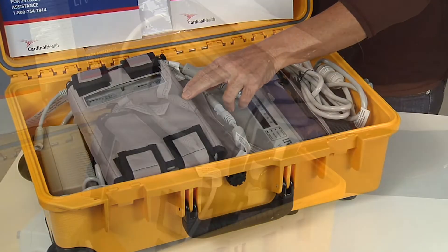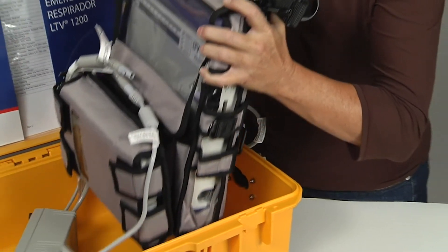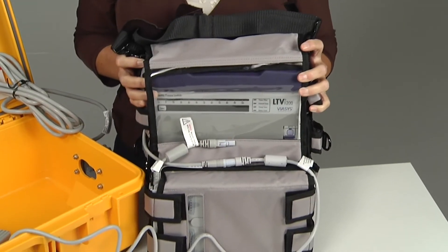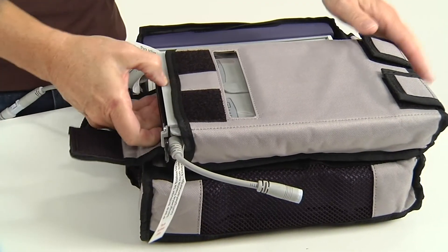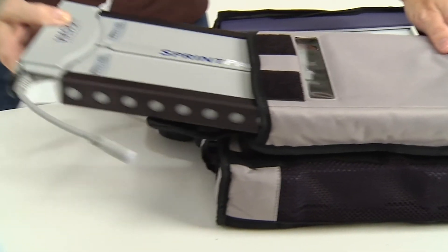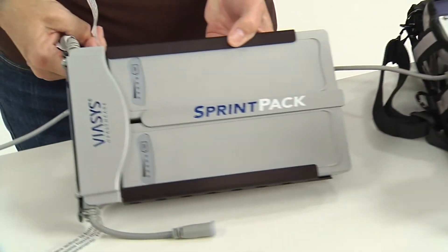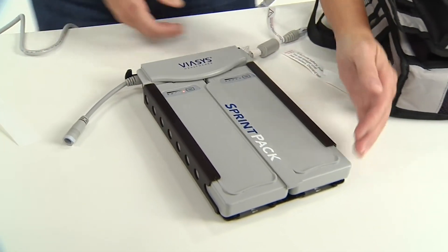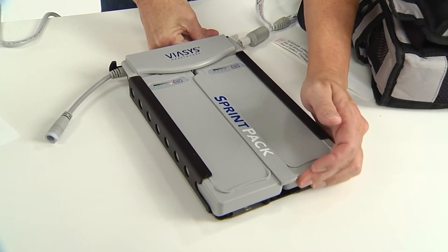The external battery found in the go pack is the Sprint pack battery system — in some cases a TBS battery — and is located in the front pouch of the ventilator backpack. The Sprint pack must be removed from the backpack and the plastic isolator tabs must be removed from between the battery cells and the Sprint pack power manager to ensure battery contact.